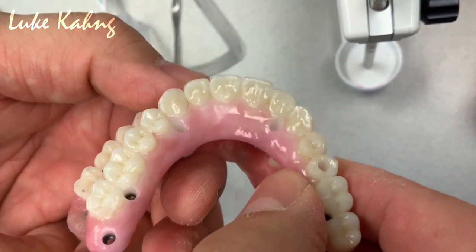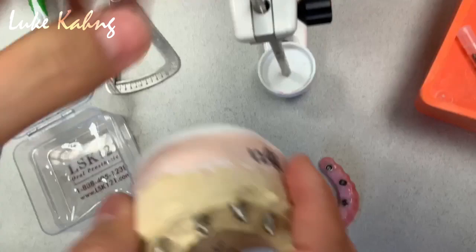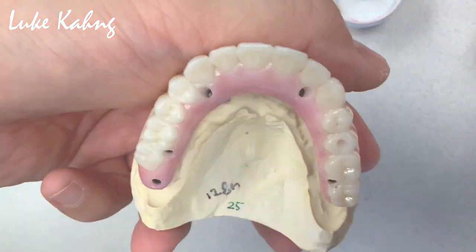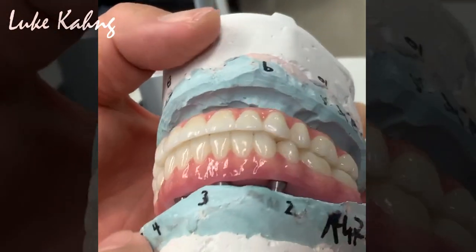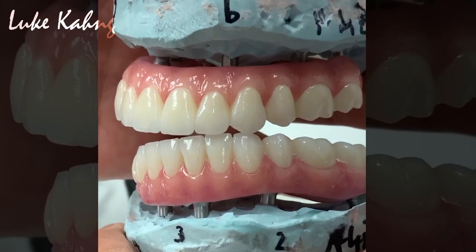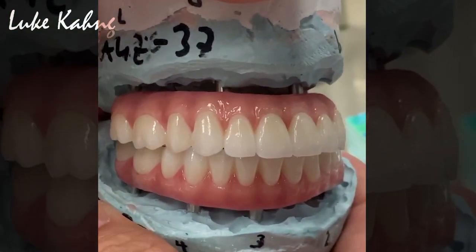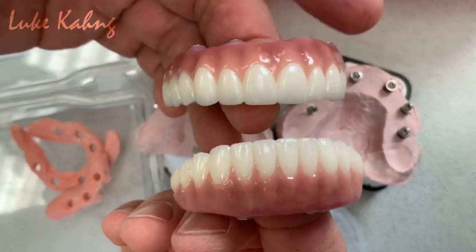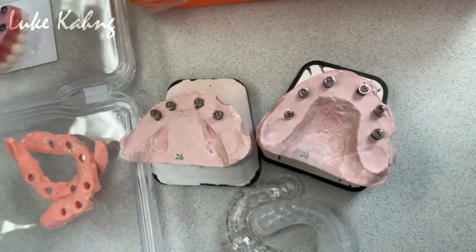Okay, that's good. And also, here's his mounting. Implant together, it just places really good. All right, this is what it looks like. Finish it. One of the collections. It's great. This is a monolithic 9 implant. Just finish this. Nice. And then 6 implants.